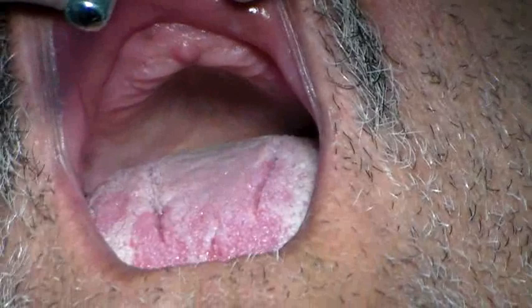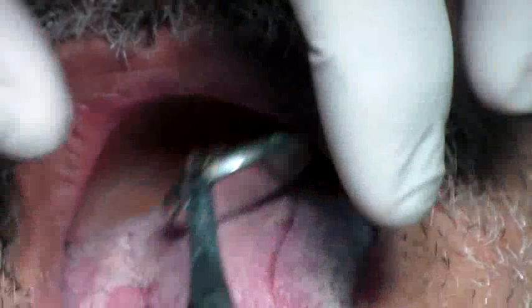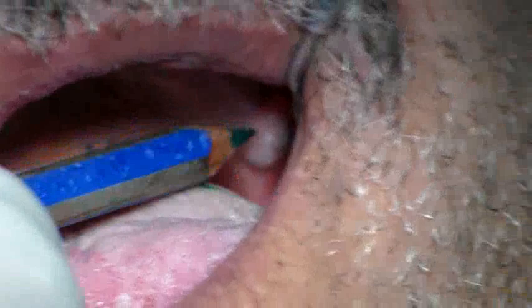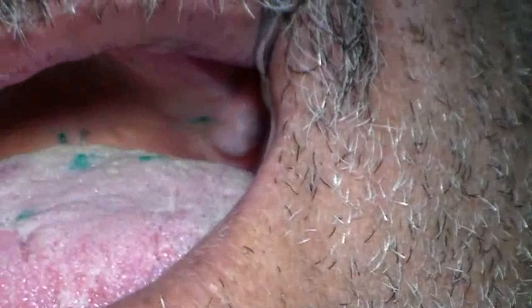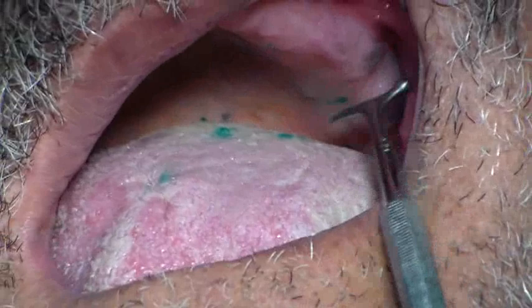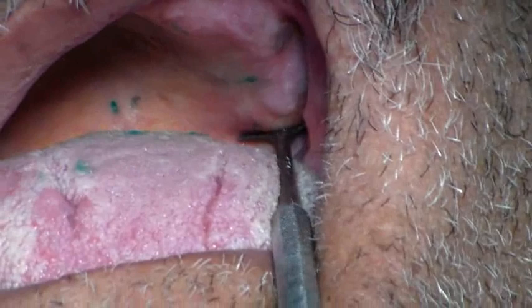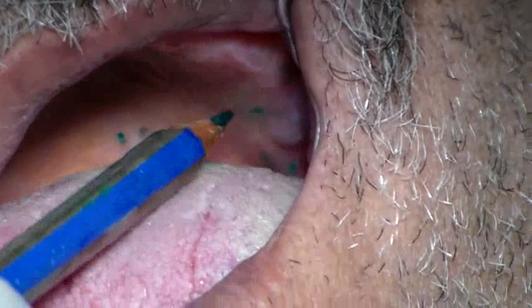The important landmarks we want to look at here are the fovea palatini and the hamular notch. You identify the hamular notch using an instrument called the T-burnisher. The T-burnisher has a ball end and a flat end. You want to use the ball end towards the cheek so you don't hurt the patient. Palpating down the ridge till it comes to the tuberosity and then it falls into a depression or notch called the hamular notch.